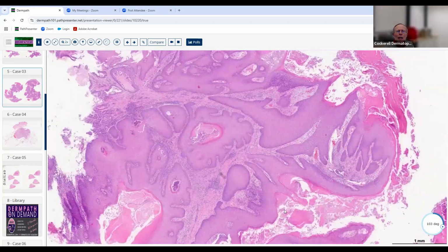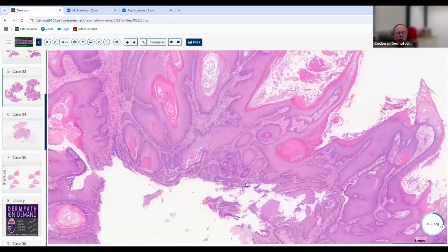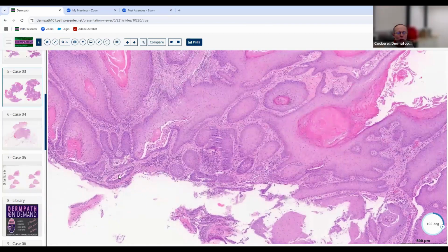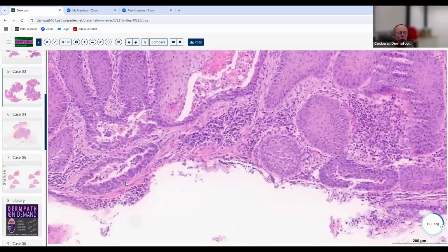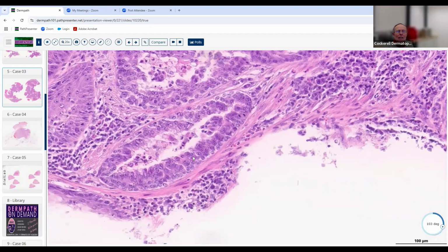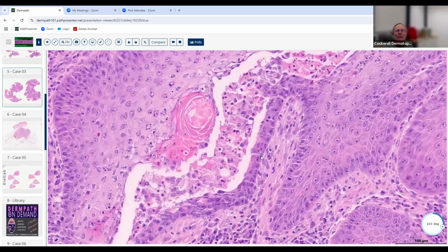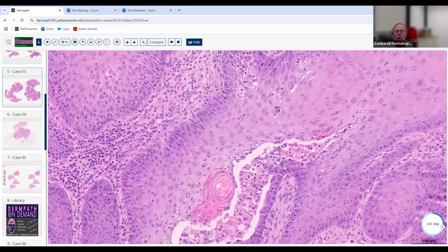This one you're not going to get on the board examination because this is a more difficult and challenging thing. But if you start looking in these zones right here, guess what we see once again? We get these cells that have the apocrine differentiation to them. Okay, it's got a couple of mitotic figures in here, but that doesn't mean that it's malignant. And this was also on the breast.